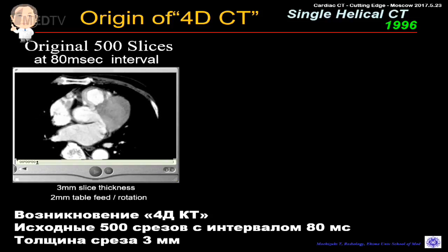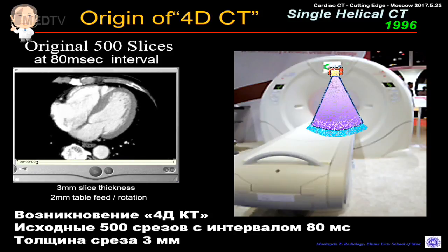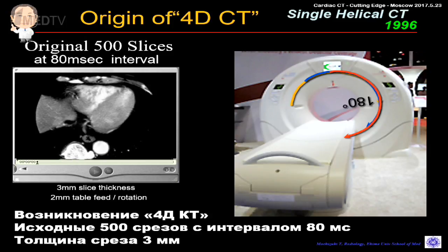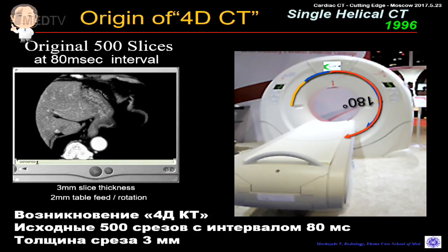So you can see the motion. This is ECG non-gated. CT can make an image using the half rotation data. So I started the next slice when we go to 1/10 of the rotation, and then repeated again. And this is the paging of the 500 slices.